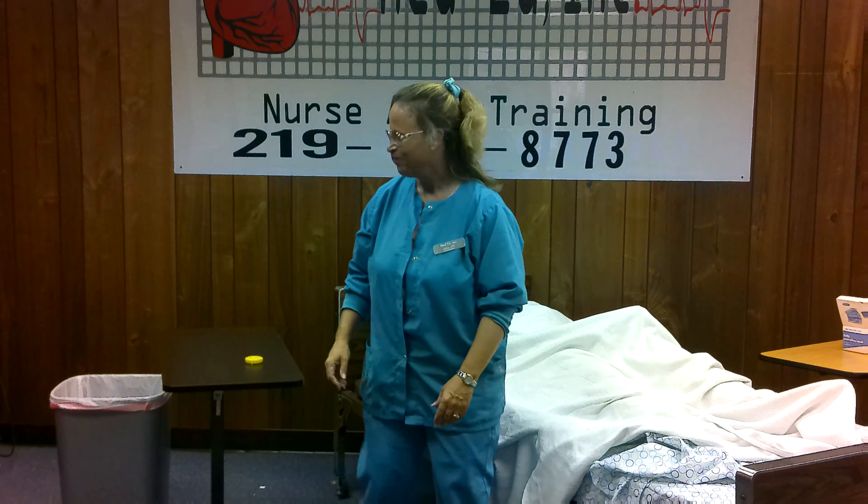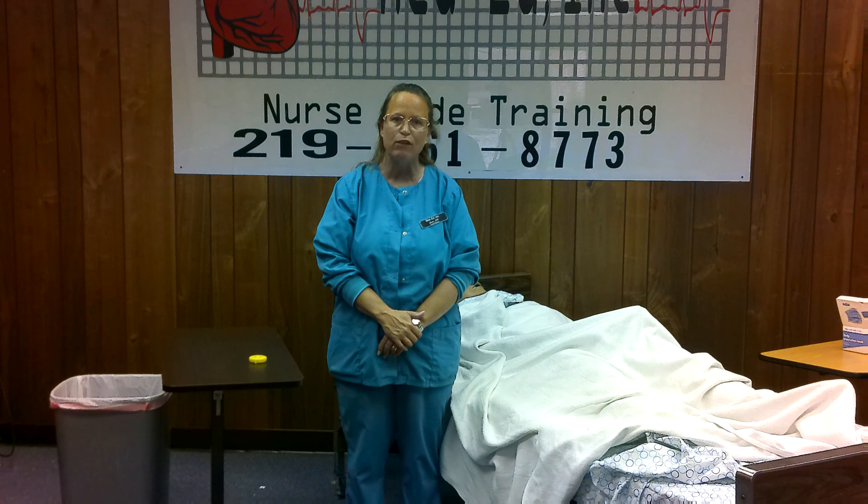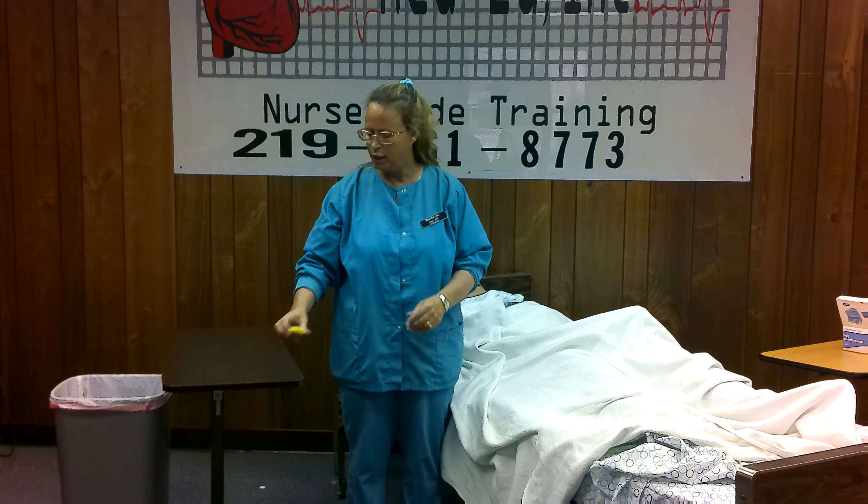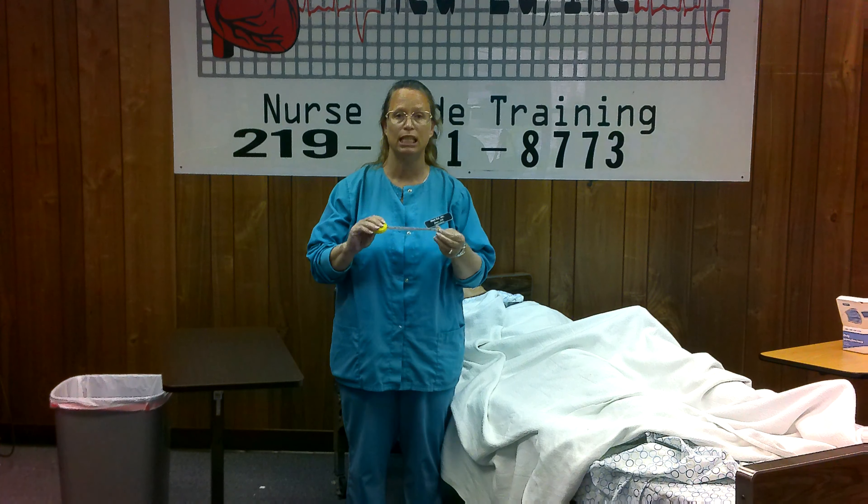Hi, everybody. I'm back. I've got my tape measure to show you how to get somebody's height if the resident is on bed rest. If the resident is on bed rest and they are unable to leave the bed, we're going to use a tape measure to get their height.